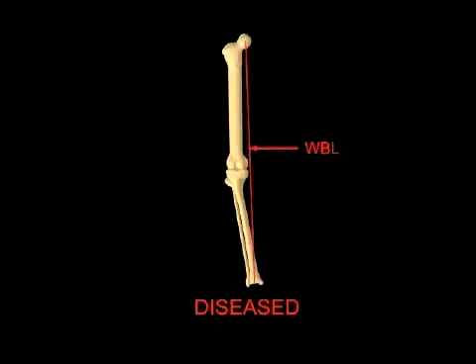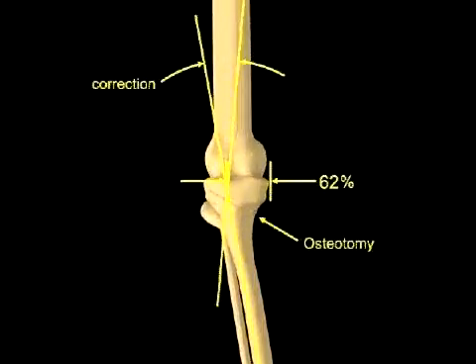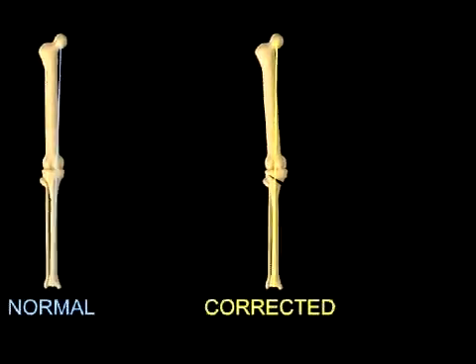The correction needed is determined by using standing full-length radiographs. Allowance is made for magnification. First, a line is drawn from the femoral head to a point on the lateral aspect of the tibia that is 62% of the width of tibial plateau. A second line is drawn from that point to the center of the tibial talar joint. The angle created by the intersection of these two lines represents the angle of correction needed. Usually 1 degree of correction is made for every millimeter of opening of the osteotomy.